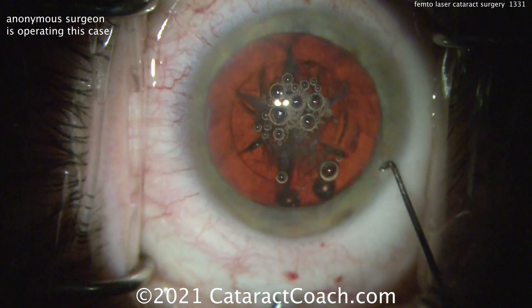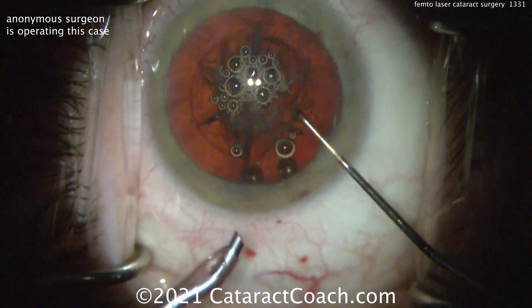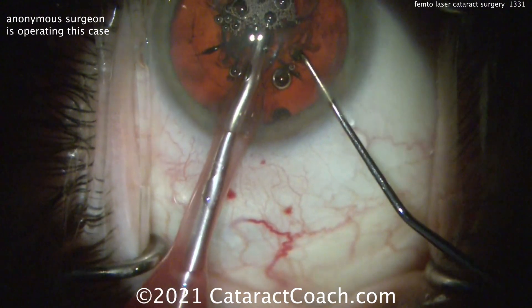Now you should obviously still learn and master the skills of doing the surgery without using the laser, because it's a very expensive tool. But if you have access, yes, of course — learn everything.